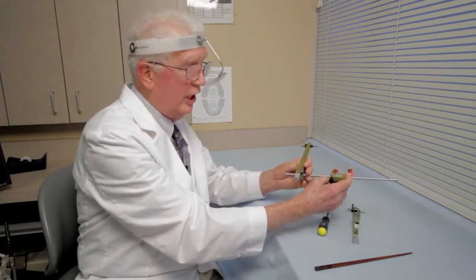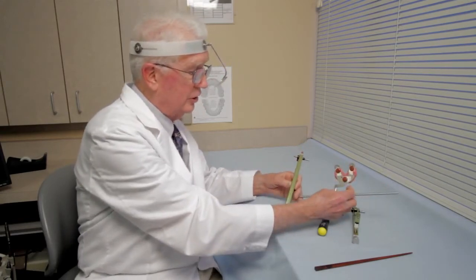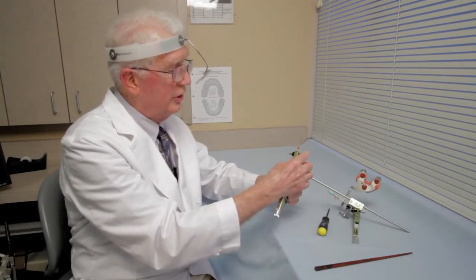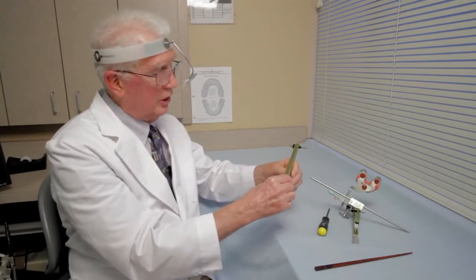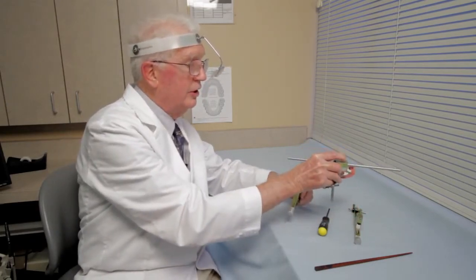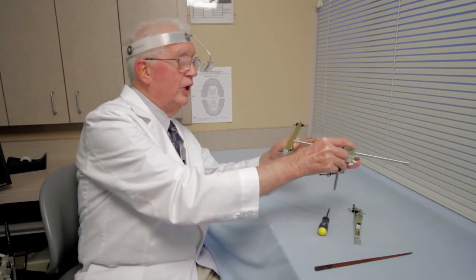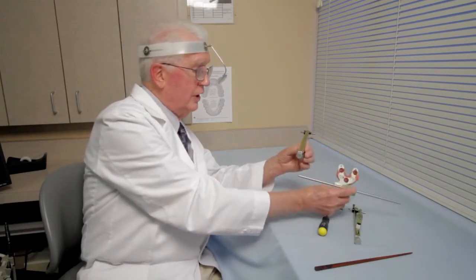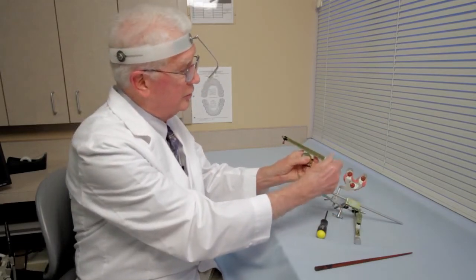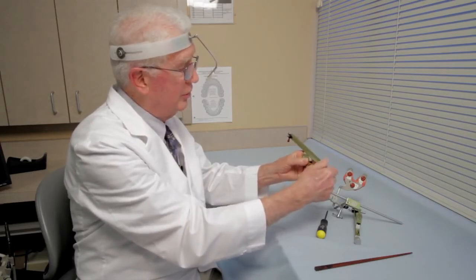I don't want to start out using the point and move in and touch the patient's face because it would hurt the patient. And so it can move in and touch the patient's face with the dull point, and then we would reverse it. But first, before I did that, I would put this in the patient's mouth, and then I would look at the side arm and judge how far it is to the hinge axis point on the patient, and I would make my gross adjustments here so that I wouldn't be adjusting so much on the patient.